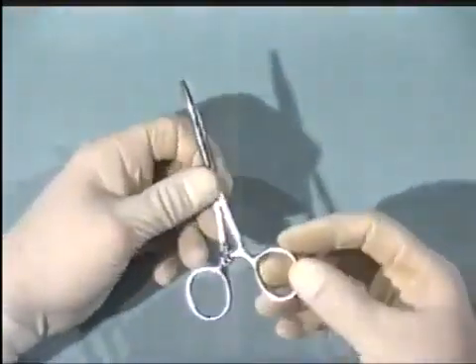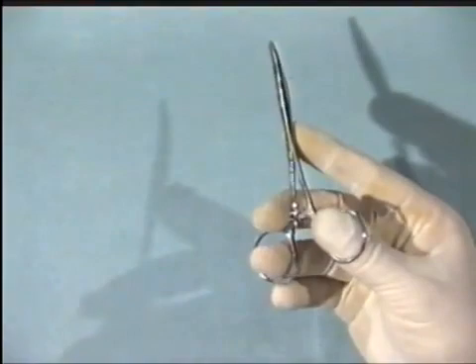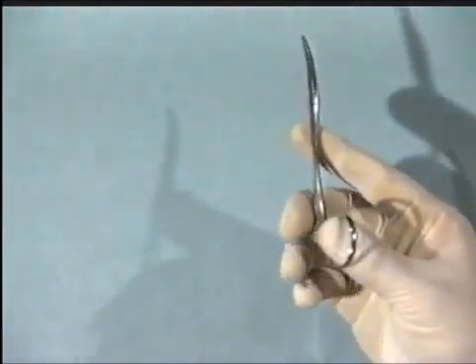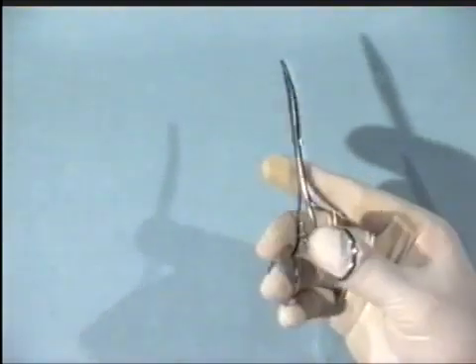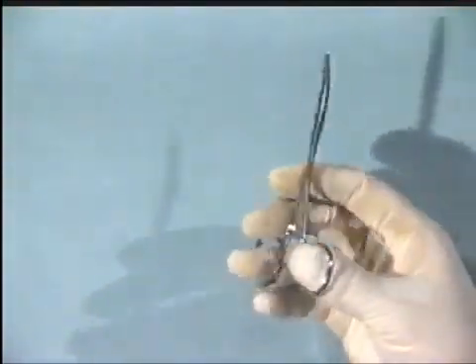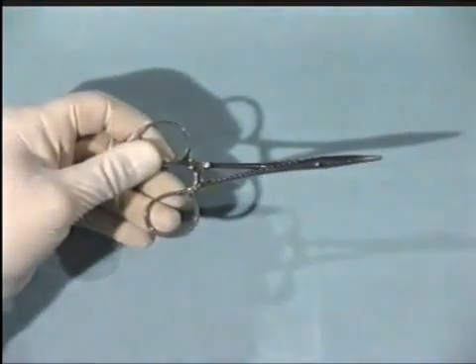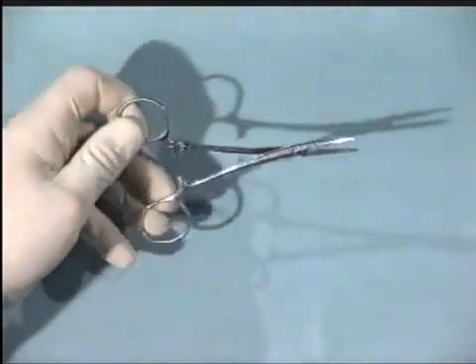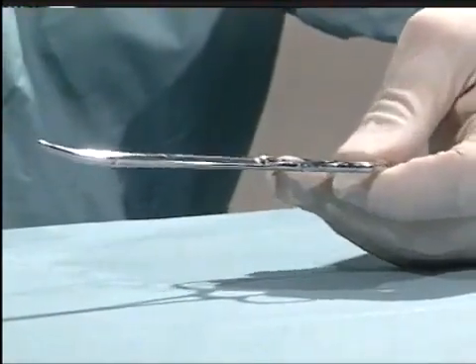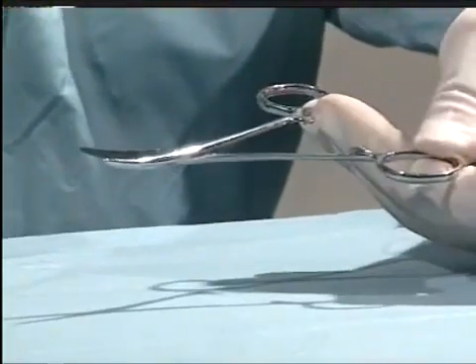Now let us consider the hemostat. Correct handling of the hemostat is critical. Pick it up much as we did with the scissors, using the distal phalanges, and as one is opening them, put pressure on the thumb against the ring finger and middle finger, and then the hemostat opens gently in a controlled manner. If holding it in your non-dominant hand, put pressure from the middle and ring finger against the thumb and index finger, and open smoothly. Do not let the hemostat jerk, as this can do damage to any blood vessel it might be holding.